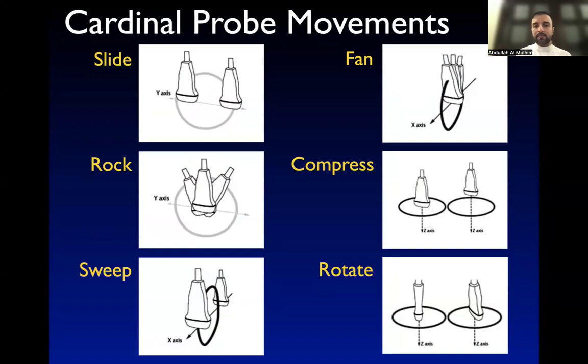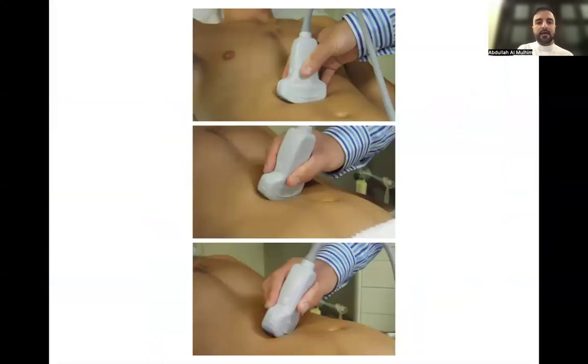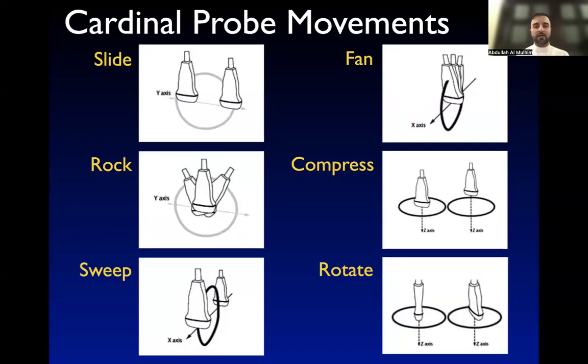You will hear a lot of things that can be used by radiologists or by point of care ultrasonographers, like sliding the probe, taking the probe from side to side, rocking the probe if you are following a hollow structure, especially if you are doing some procedures, sweeping the probe up and down, or fanning the probe if you are targeting a specific structure and looking for an abnormality, compressing if you are looking for a deeper structure, for example, something retroperitoneal, or looking for the aorta in the abdomen. And you need to compress for an artery or vein or to find an abnormality.